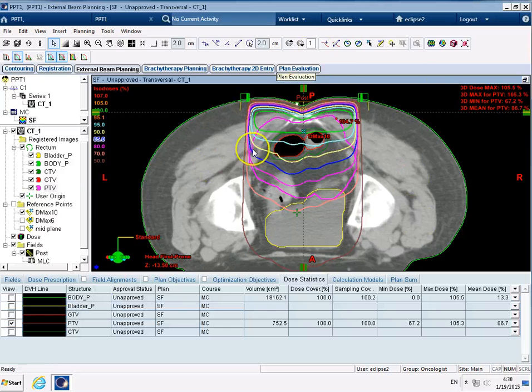So either 6 or 10 MV, we've seen there that actually there's a number of limitations to using a single field, and it's something that we only want to do in a very simple setting where we're wanting to give a dose to a patient, and where we're not overly concerned about conforming to that PTV with a minimum of 95% dose all the way around, as we would do if we were treating with a radical or curative intent.